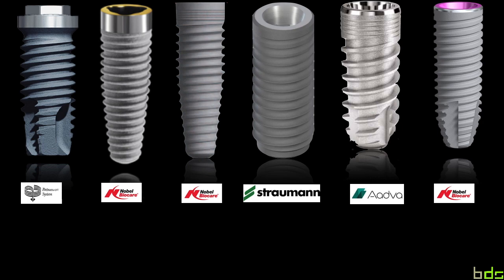Yet this again showed that this could be a problem, when you have an exposed roughness of the implant surface, or you have a dieback of the bone in the first thread, then you have an exposed surface. Then these implants were more prone to peri-implantitis.